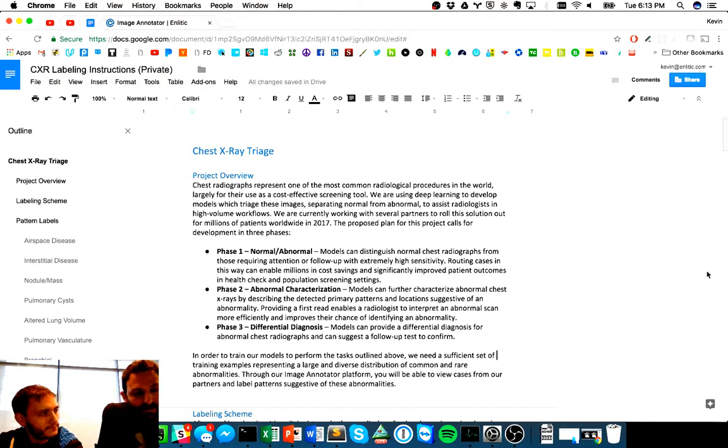It is really of critical importance that you understand the instructions very well. They're designed to help and encourage everyone to continually refer back to the instructions at any time if you've got any queries. And also, if you've got any queries at any time, you can message Enlitic. Yeah, and this document that you see open here on the screen now is that instruction sheet that we're referring to. We'll send this out to you, so you should have a copy of it.